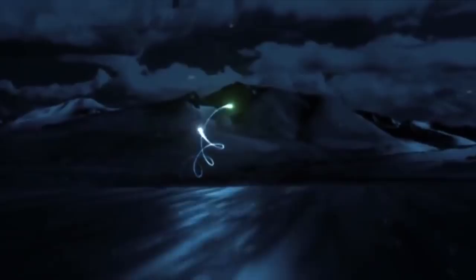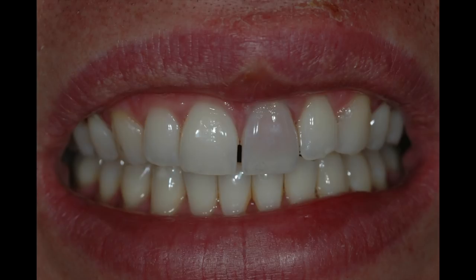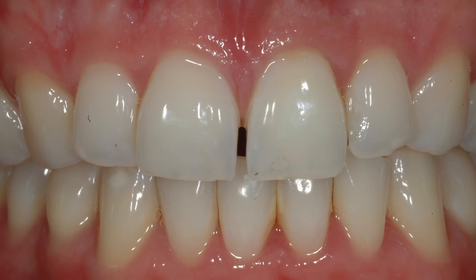Let's talk about internal bleaching of a dark tooth. You can see this young man has had a bicycle accident. As is often the case, the tooth is damaged and it turns dark. The blood inside the tooth gets into the dental tubules and it makes it dark. I'm going to show you how to go from a dark tooth to here — a very simple, straightforward technique. This is the final result that we're going to demonstrate this morning how to achieve.